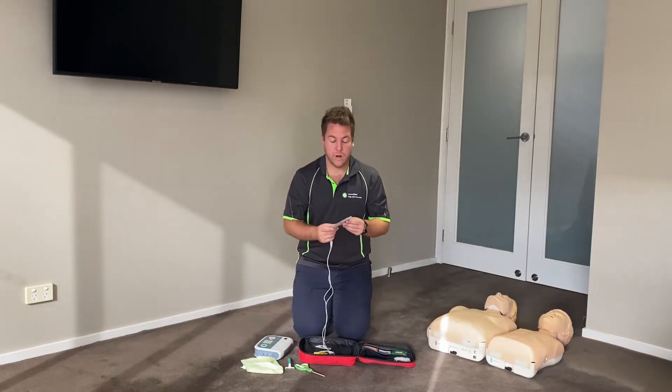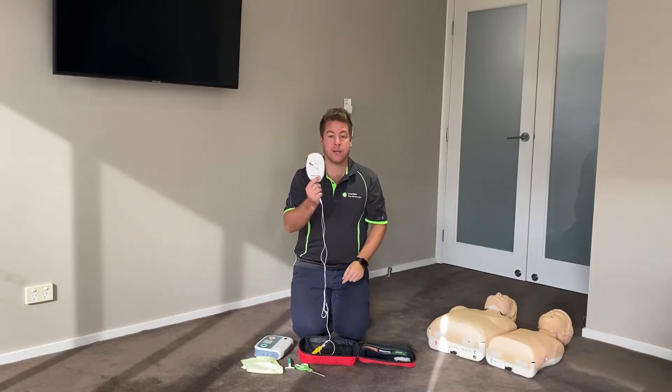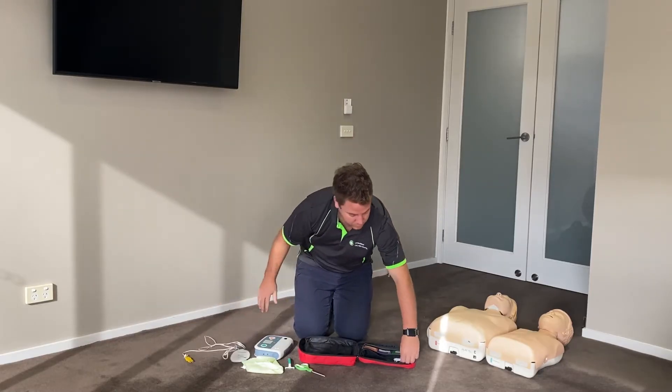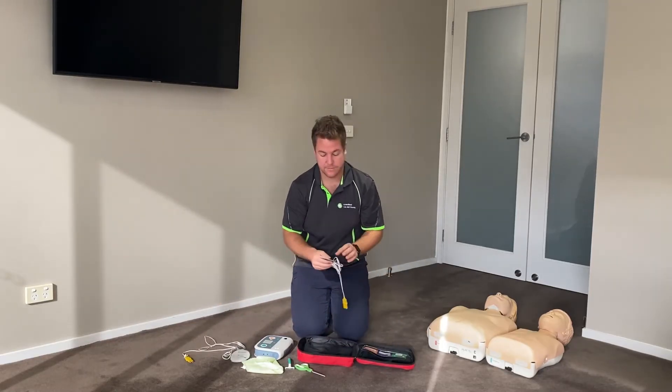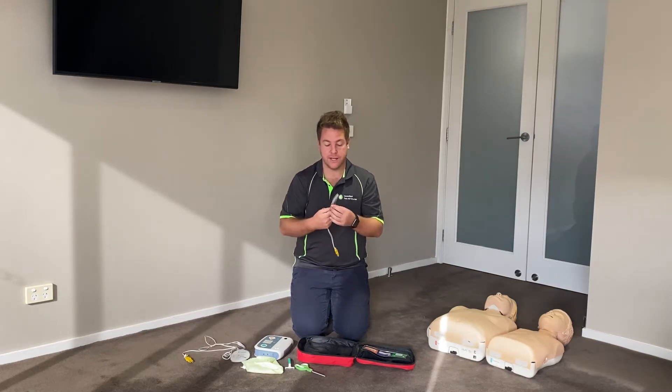In your kit you will have adult pads, and on these pads is a diagram showing where to place that specific pad. The bigger pad is the adult pad. You will also have children's pads, and again, on the pads will be a diagram showing where you need to place that specific pad.